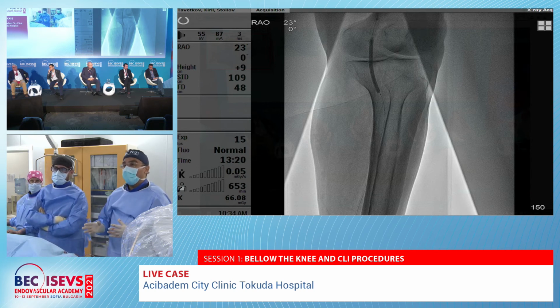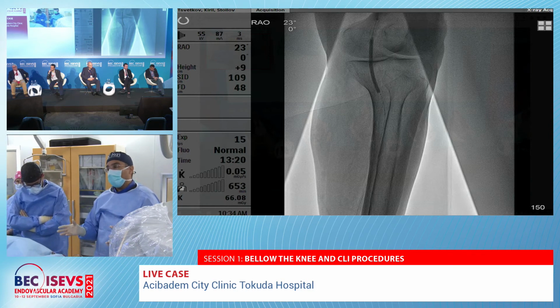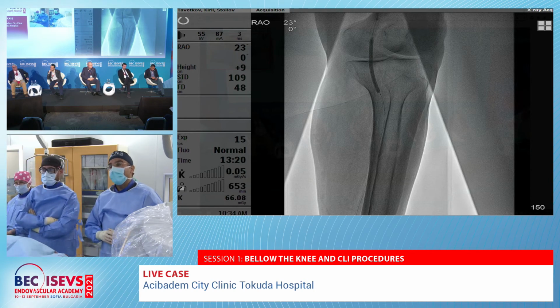This is what we're doing, for example, in vein thrombectomies, where we want to go through the iliac veins. We are using the pigtail, injecting rTPA until we prepare the thrombectomy catheter, be it Penumbra or Rotarex or whatever you want. Then we are leaving enough time for rTPA to do the job.